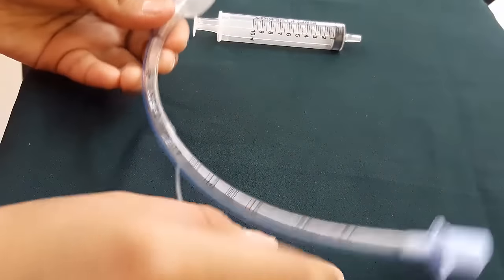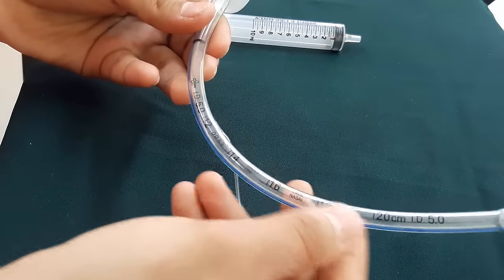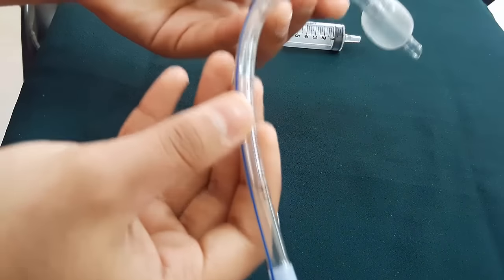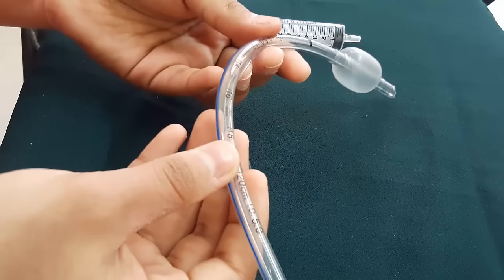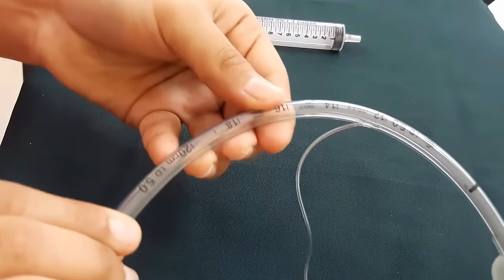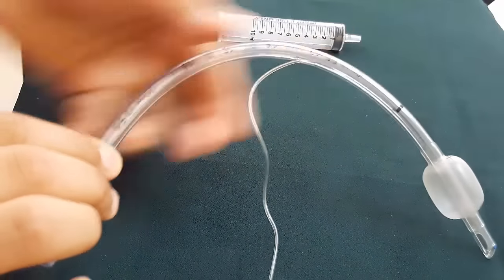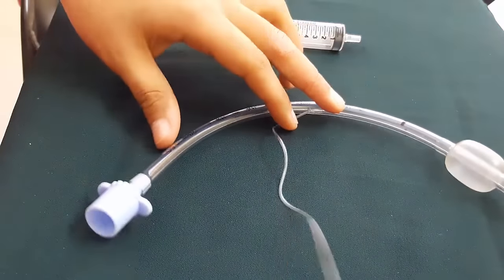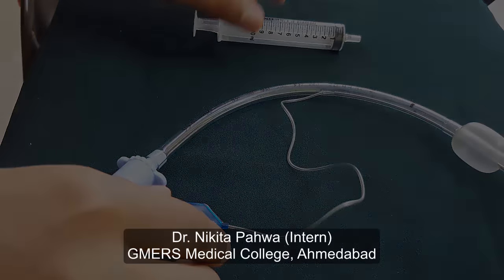Talking about the length markings — as you can see, markings at 12 cm, 14 cm, 16 cm, 18 cm, and 20 cm. These are referenced after inserting the ET tube using landmarks such as the incisor teeth or lips. This helps determine whether the endotracheal tube has moved outward or further into the bronchus. If the ET tube is too long, it can result in kinking and obstruction. This was all about the parts of the ET tube and their significance.